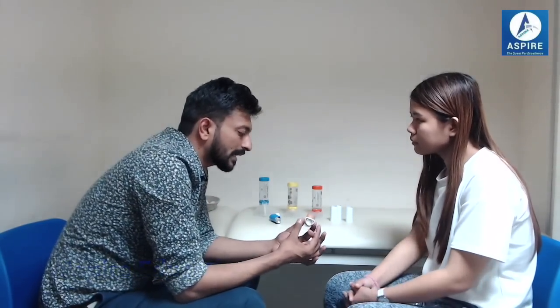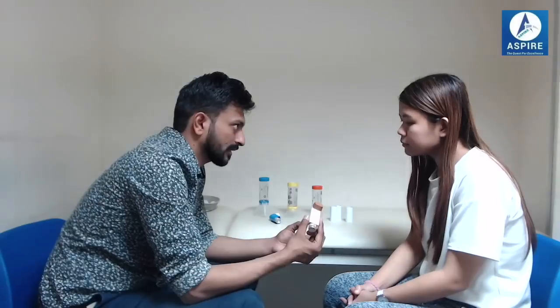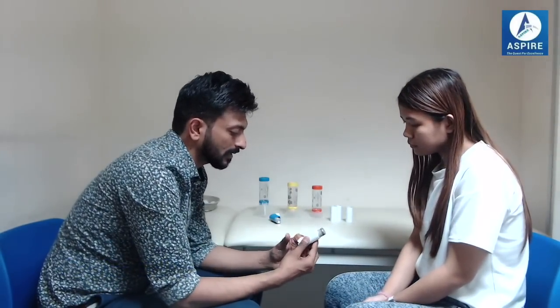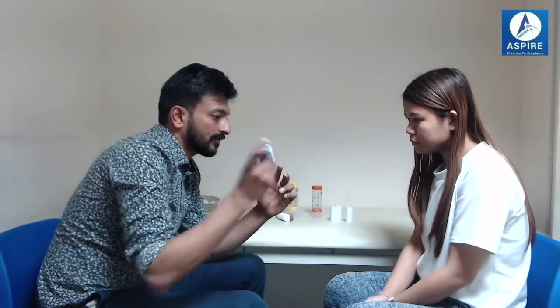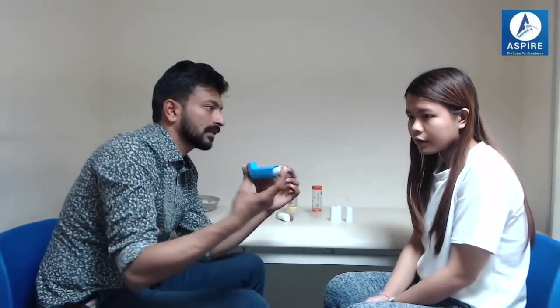This inhaler also has side effects — sometimes we get an infection in the mouth. But if you rinse your mouth or brush your teeth after every use, we can tackle that. It's advisable to keep this in the washroom so you remember to rinse your mouth after every use. Now, how to use the inhaler: first, shake it well. You can check the expiry date from here. If you have not used it for some time, after shaking, make a puff in the air — then it is ready to use.